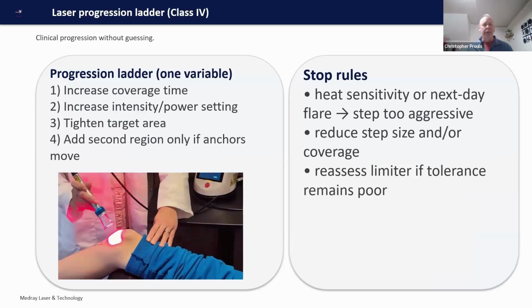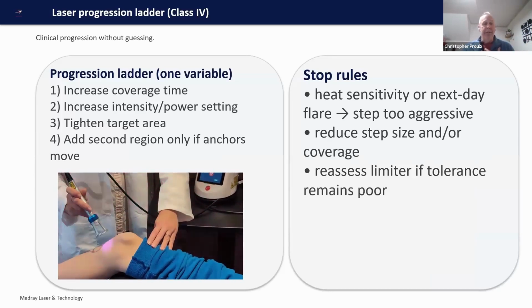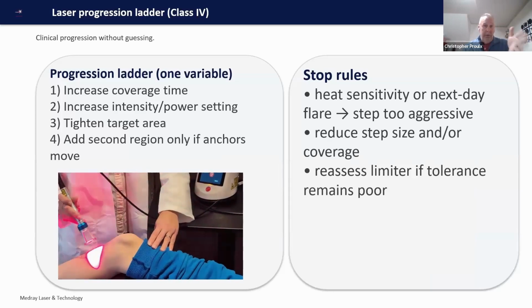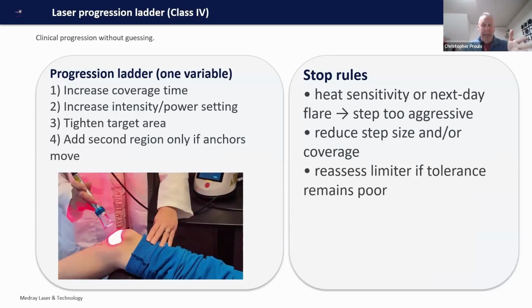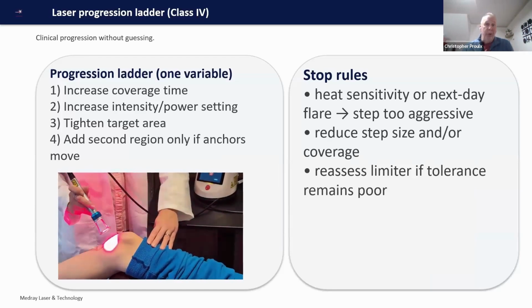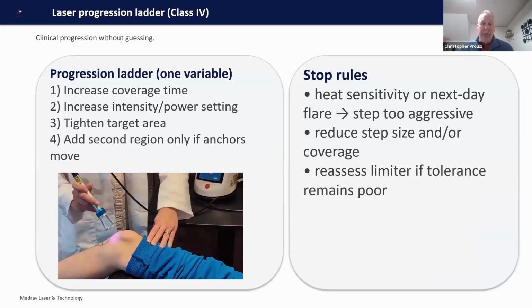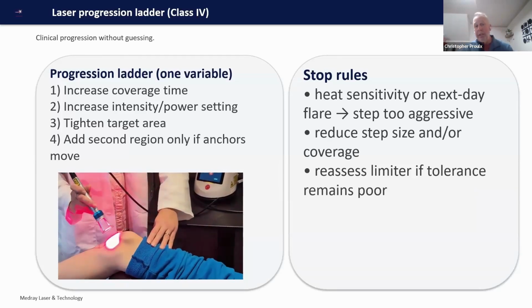I could potentially increase the energy density, right? A lot of these devices have presets. I often start with a half to kind of develop and see. Now, again, it's a high intensity light, and so do you know if they're photosensitive or not? I mean, obviously, we're going to ask them. Sometimes people don't know till after they've been treated. Sometimes, yeah, we told them not to put any lotions or things like that on.